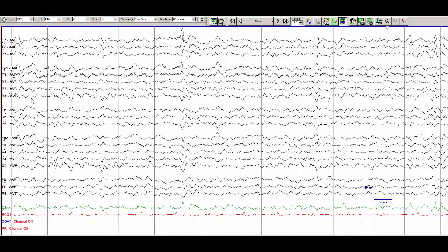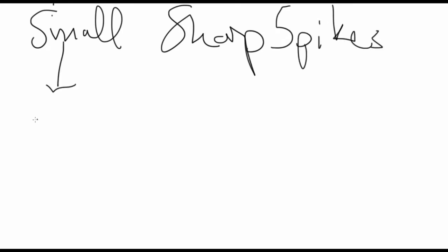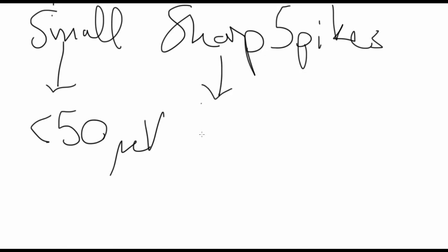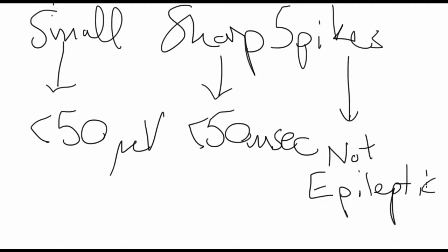This is very different from the small sharp spikes we saw before. To summarize, small sharp spikes are characterized by their features. They are small in that they are usually less than 50 microvolts in amplitude. They are sharp in that they are typically less than 50 milliseconds in duration. And they are spikes in that they are sharply contoured, but they are not epileptic and are a benign variant.